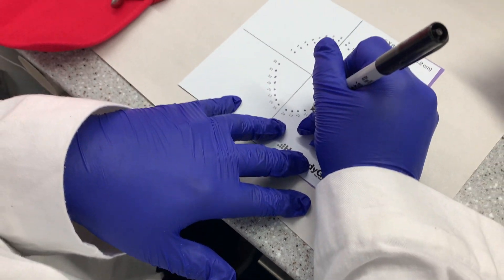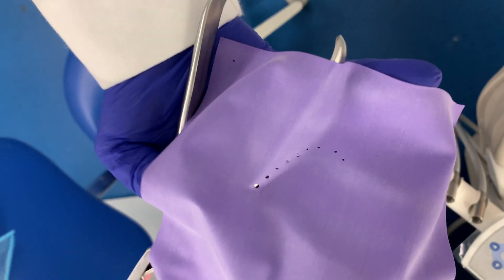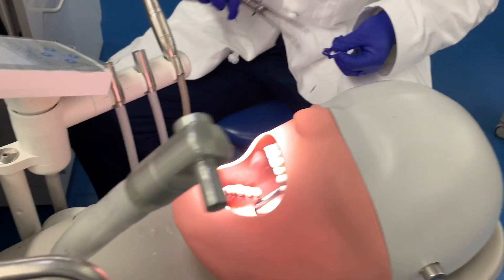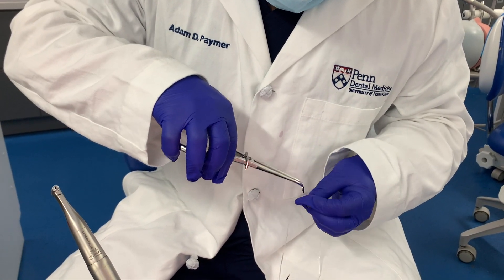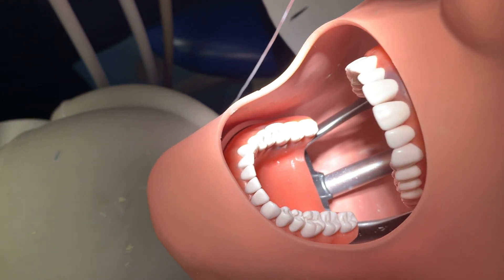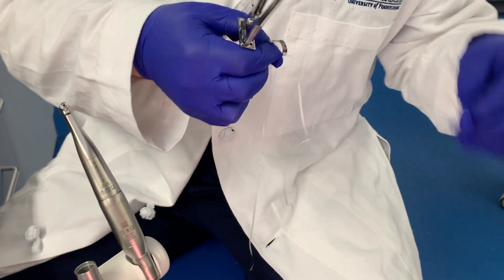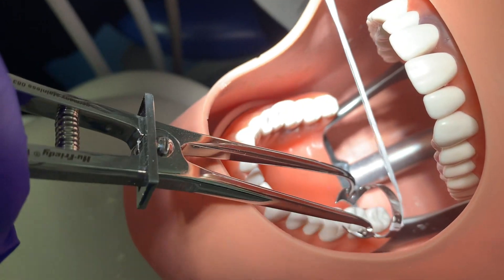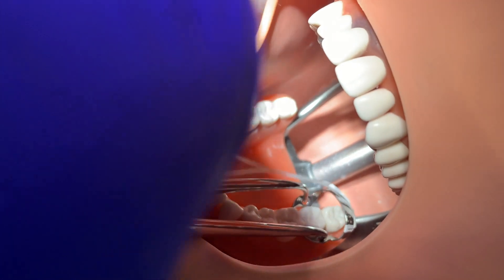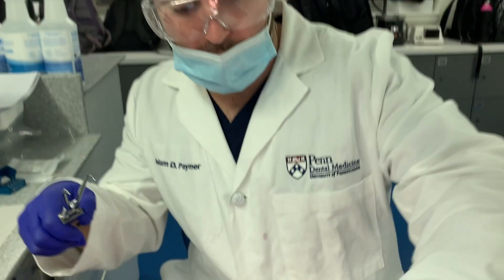We're working on some rubber dams. Adam is dialed in making some dots — places to be, things to do. Just poke some holes into the rubber, looking good. We're placing the rubber dam clamp here, trying our best to not drop it. Round two: open it up, squeeze hard, and put it a little bit lower — right on the tooth, getting it right in there.